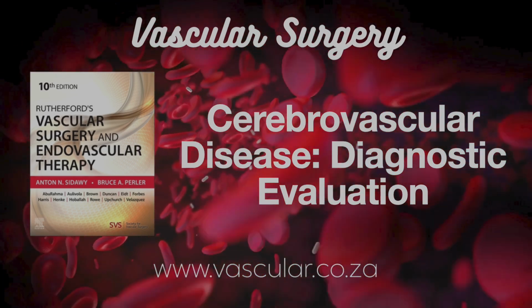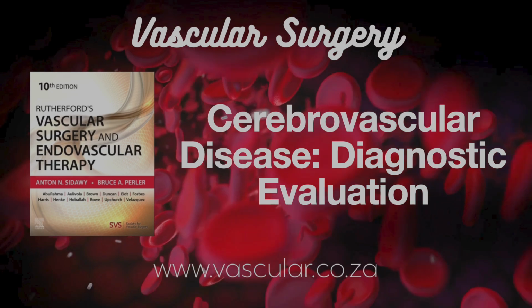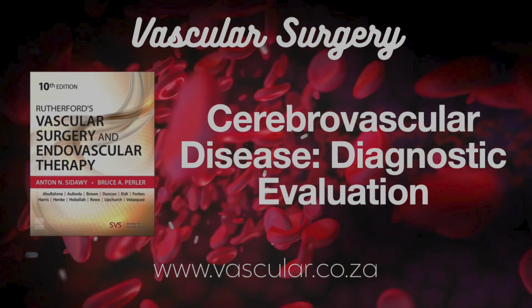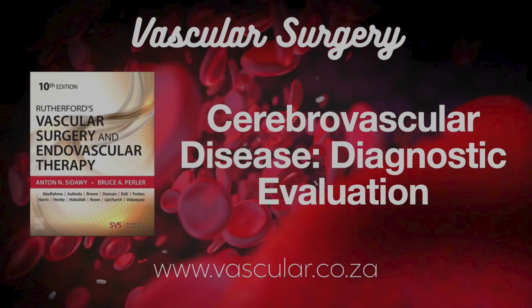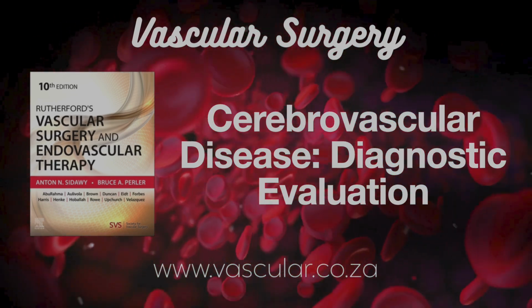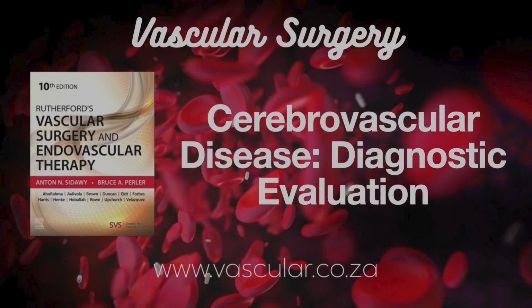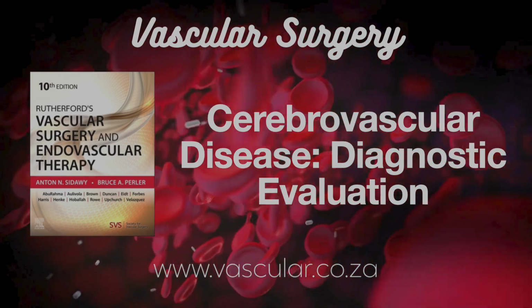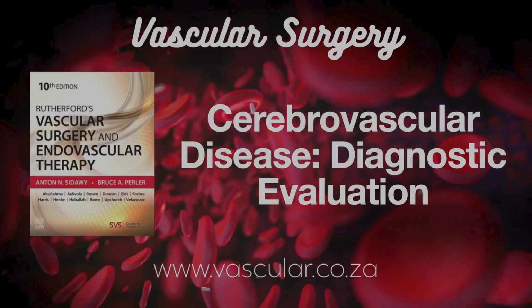Plus, from a single scan, you can reconstruct images from basically any angle you want. And like CTA, but unlike DUS, it can see areas ultrasound struggles with, vessels in the chest or deep inside the skull. With special MRA techniques, you can even start to analyze the components within the plaque itself. Seeing inside the plaque. That sounds potentially very useful. Yeah. Let's break down the two types.